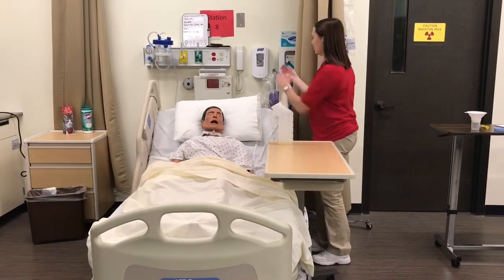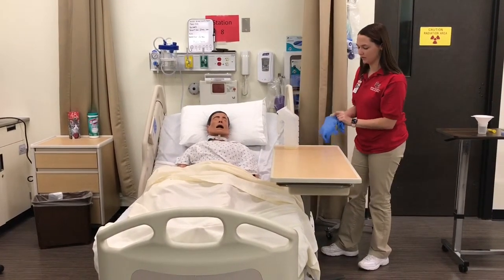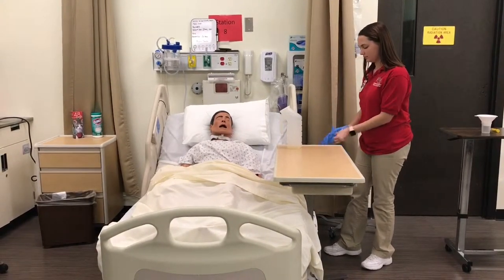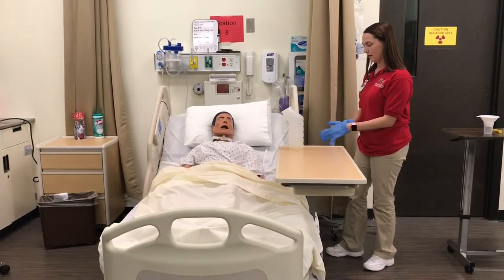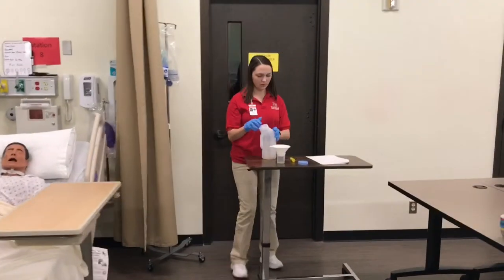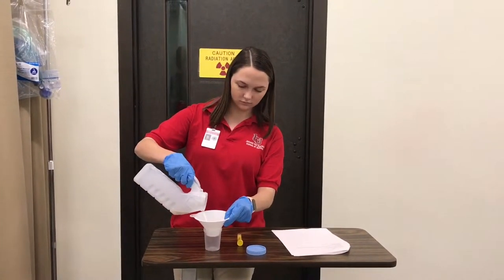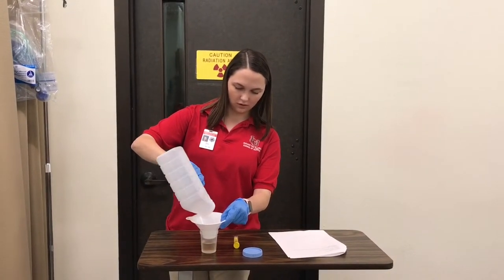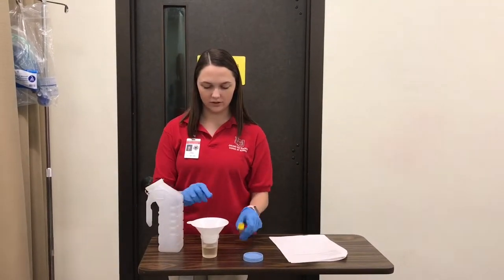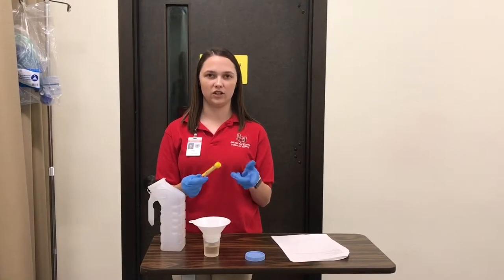Mr. Zang, I'm here to get your urine sample so we can strain it. I'm just going to do hand hygiene and put some gloves on. I'm just going to take the urine to the bathroom so I can strain it. We're going to pour this through the strainer. It looks like there is a kidney stone in there, so I'm going to put that into the specimen container and label it and send it off to the lab so they can figure out what kind of stone it is to treat the underlying issue.